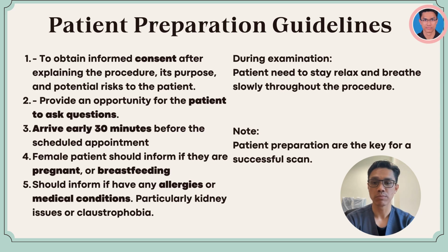For allergies and medical conditions, patients should inform the healthcare provider if there are any allergies or medical conditions, particularly kidney issues or claustrophobia, as this may affect the procedure or require special accommodations. During the examination, patients need to stay relaxed and breathe slowly throughout the procedure. To take note, patient preparation is key for a successful scan.